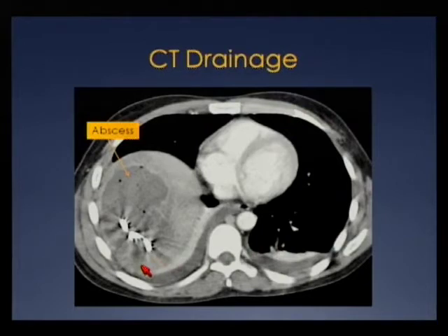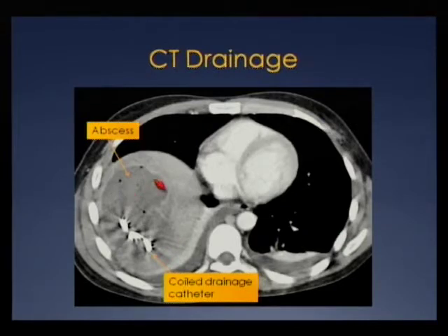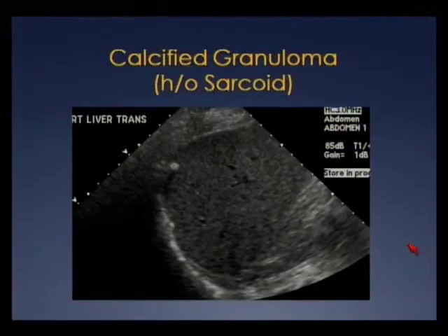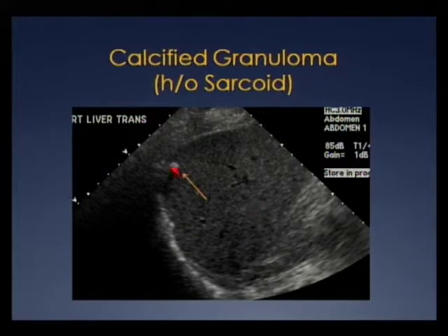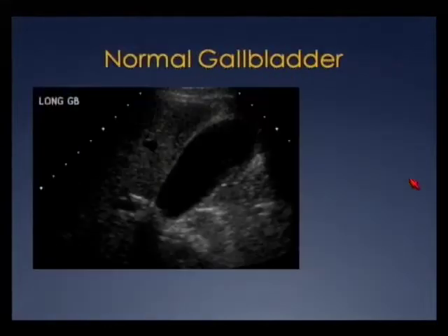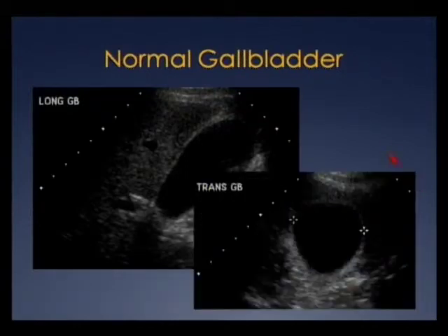This illustrates the multi-modality approach to abscesses — this patient was drained under CT showing a large hypodense collection, foci of air, enhancing capsule, and coil drainage catheter. Here's a cute little granuloma with posterior shadowing in a patient with sarcoid. We frequently see granulomas, but when they're tiny, we usually won't see this focus of shadowing. Moving on to the gallbladder.